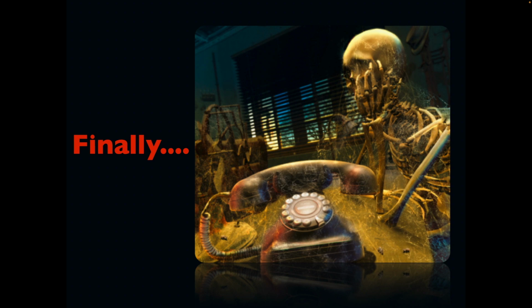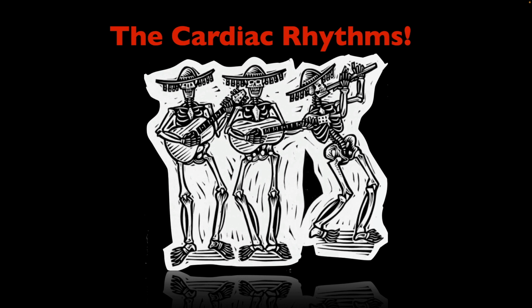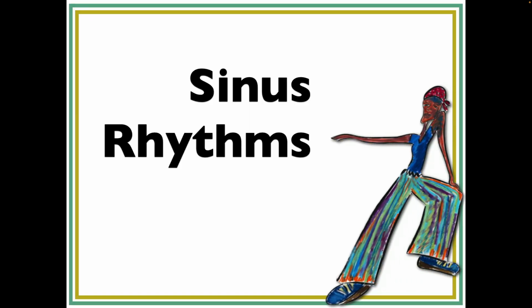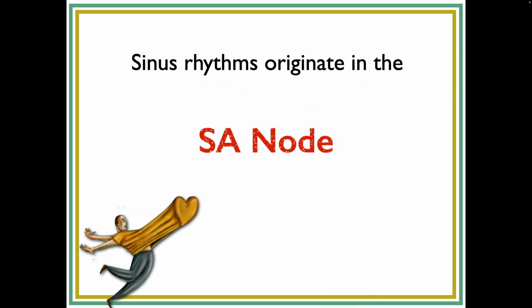So we're finally going to start talking about the cardiac rhythms. We've done all the background work, and we're going to start with sinus rhythms. So, Anne, sinus rhythms, where do they originate? In the SA node, okay?